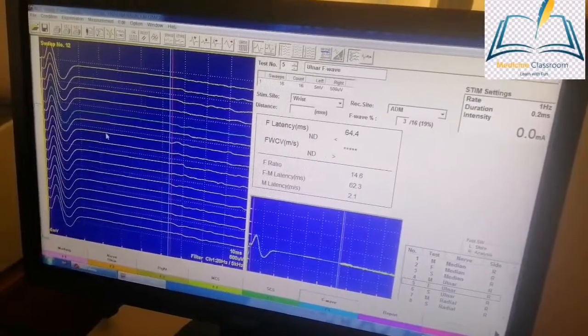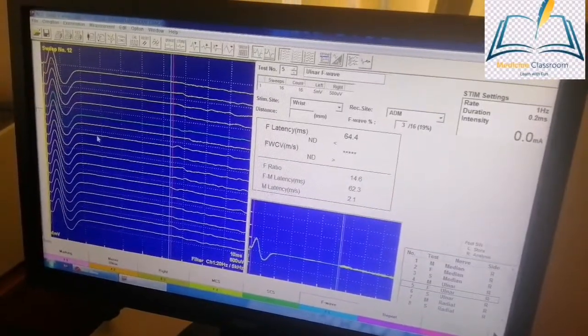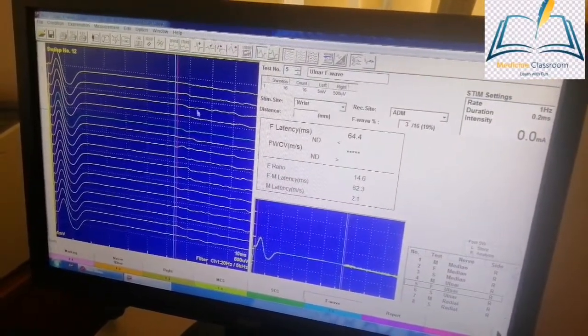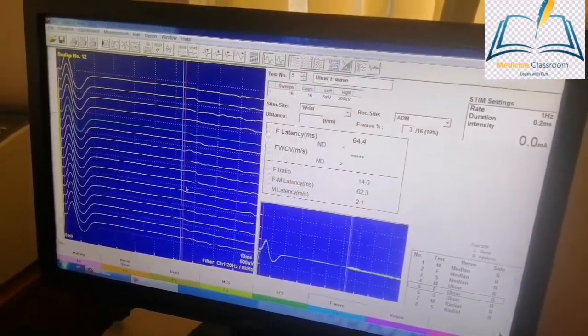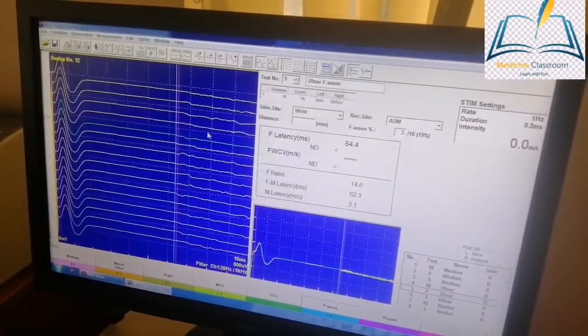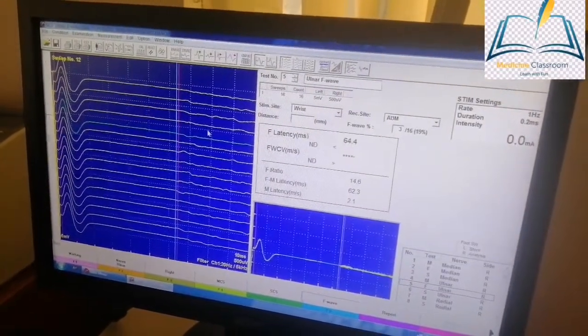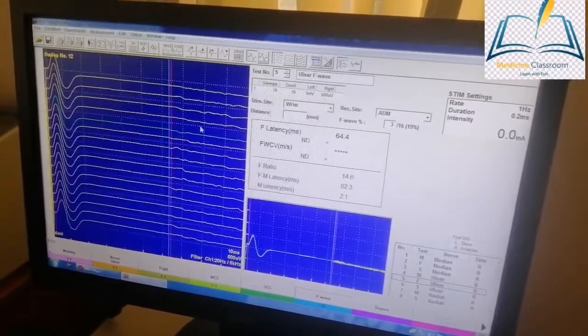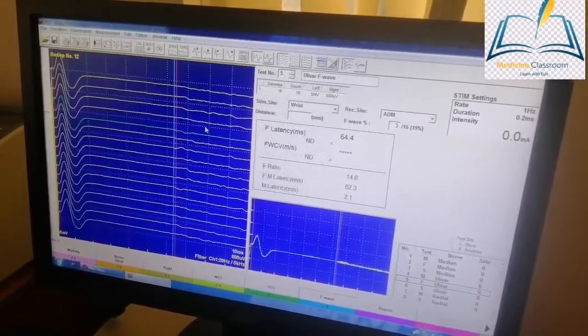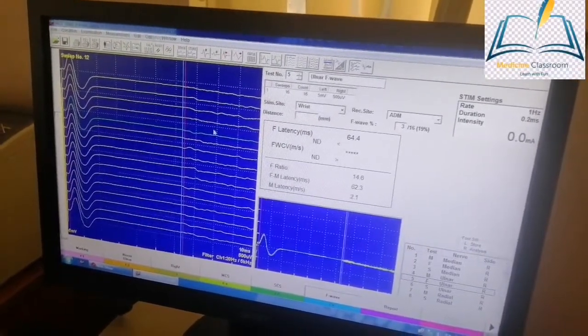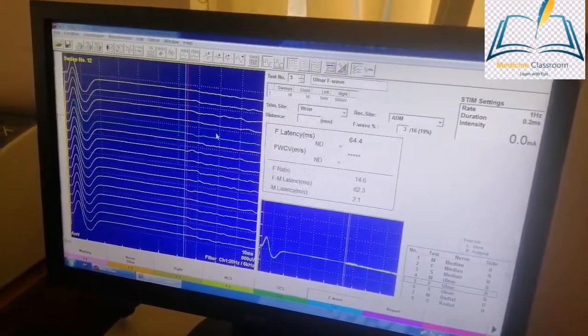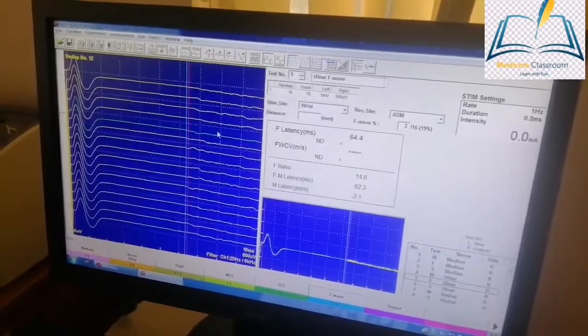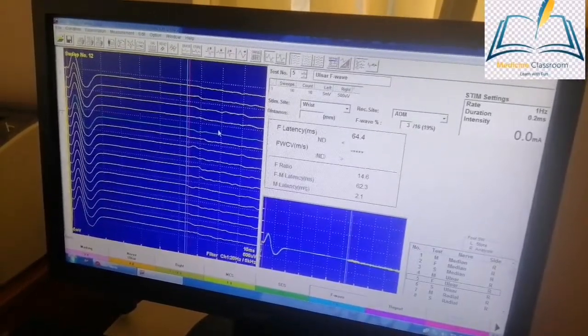Definitely there is prolongation of F wave latency. In most of the stimulus there is no F wave, meaning F wave is absent. Absent F wave and prolongation of the F wave is one of the specific findings for GBS which you can get even in the earlier phase of GBS.